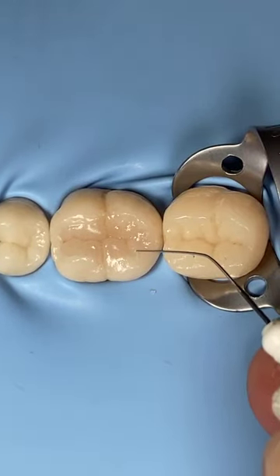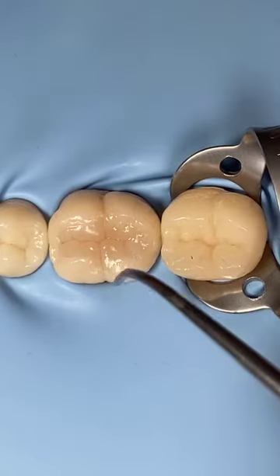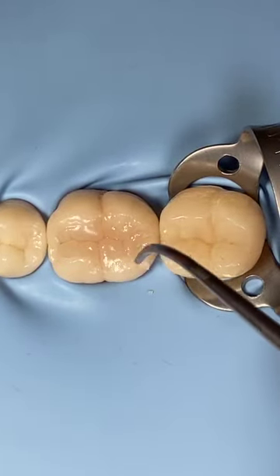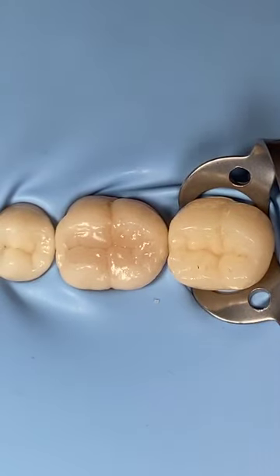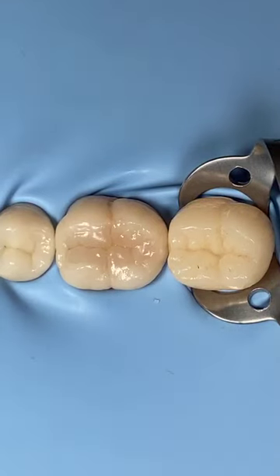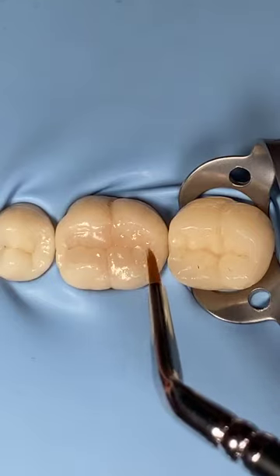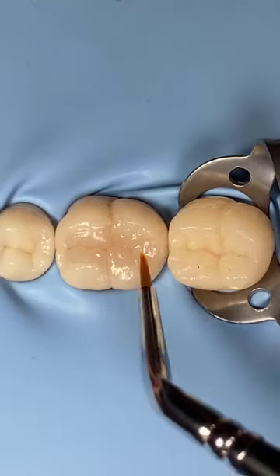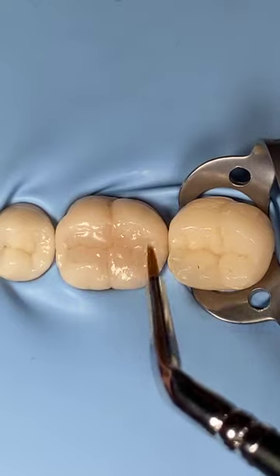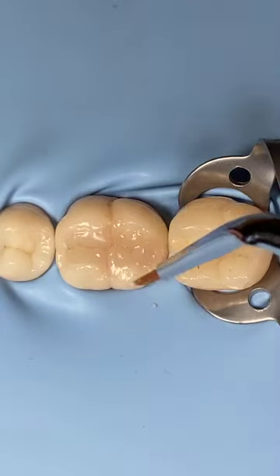I see a little bit of hair here. I don't know whose hair is this. Hair sucks, you know. Just like Corona, it sucks, you know. Okay. Make it well adapted, okay? Make it well adapted.